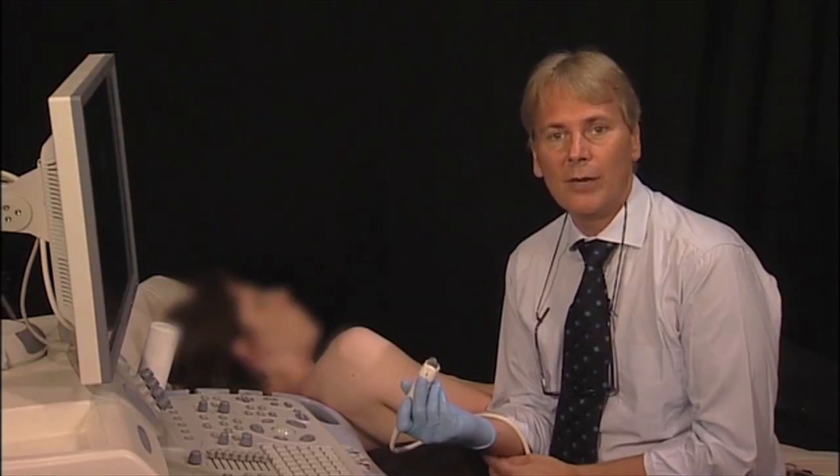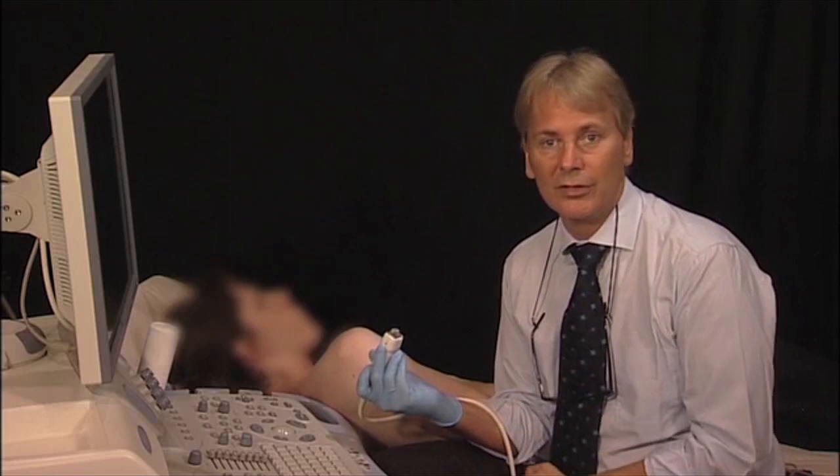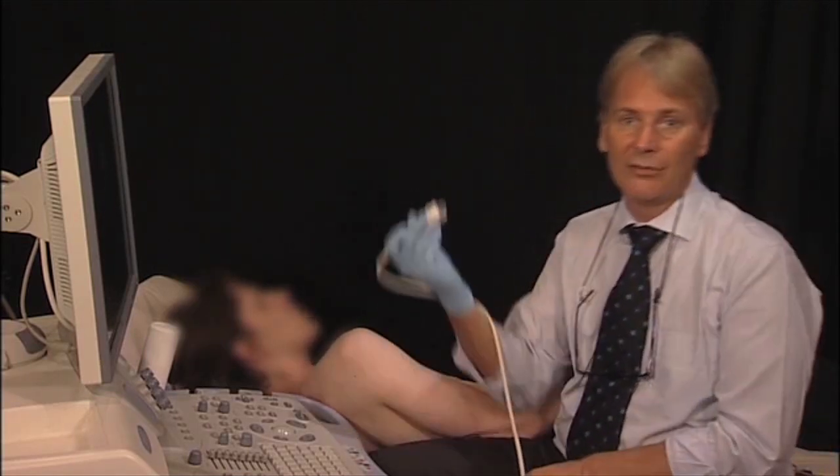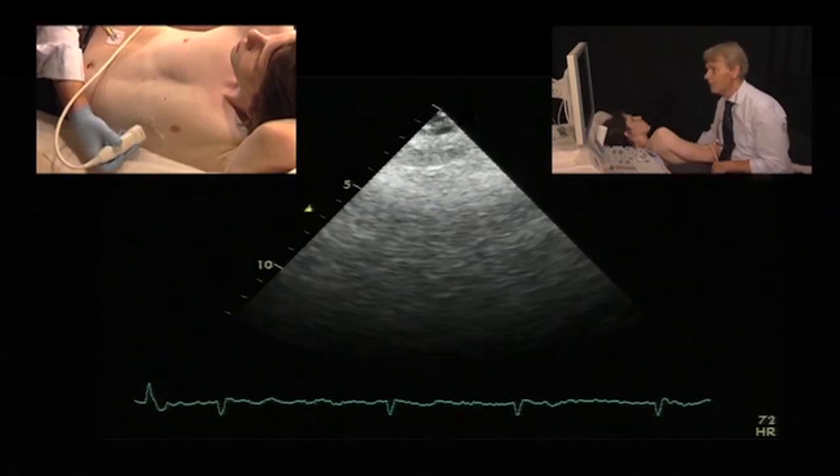It's important to use not only pulse wave Doppler, but also continuous wave Doppler in all of your patients. In the following demonstration, I'm going to show you how this is performed and how important it is to also adjust the focus point. The continuous wave Doppler across the aortic valve is very similar to the pulse wave Doppler. Basically, you would perform it when you're expecting higher velocities. But there's just a few points that I would like to make.